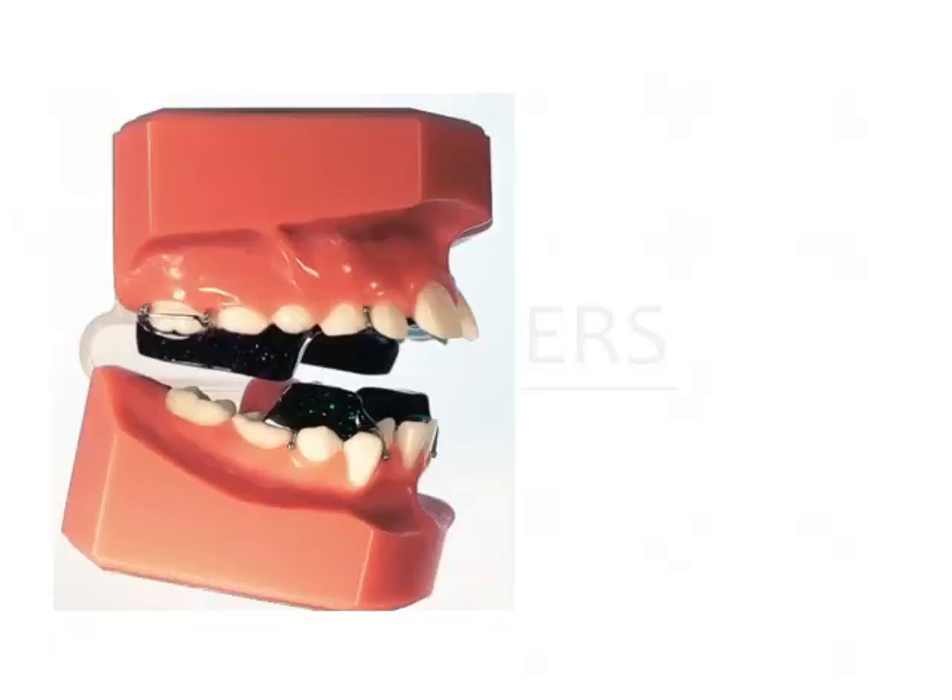Let us see the characteristic features which help to identify the twin block. Other than the fact that there are two separate blocks, as you can see in this image, which is how it derives its name of twin block — this is extremely helpful for the patient because it is very comfortable. The patient can eat and talk while wearing the appliance. Because the acrylic components are split, the patient can wear this appliance for 24 hours a day.